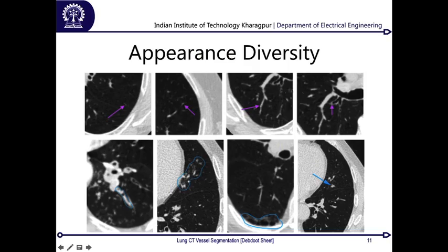Now in some high resolution versions you have these small ones very easily visible, but some of them are very low resolution, and often these bundles of vessels which you see over here would get mistaken for some sort of mucinous deposit or other kind of abnormality. Sometimes, like over here, it's possibly not a vessel, but it has an appearance similar to that. So these are all the challenges you have when looking at 2D space instead of the whole 3D space in the vessel segmentation problem.